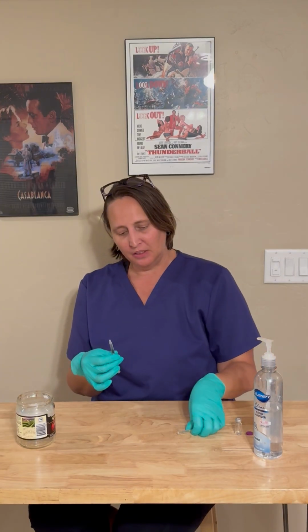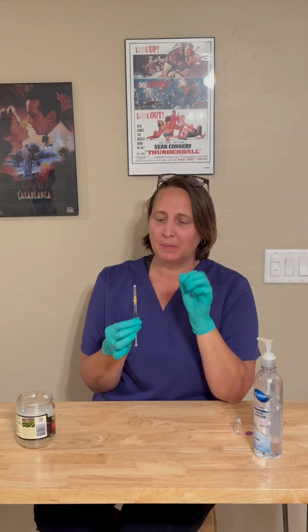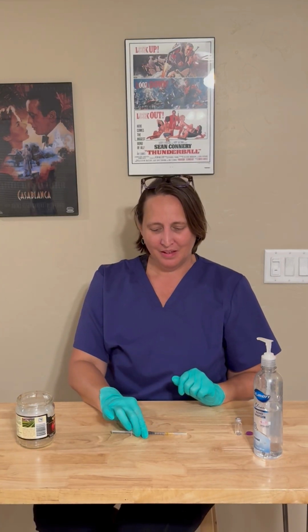Then you'll take your second needle, the one you plan to use for administration, and put it on your syringe. A sub-Q injection is typically given with a 25 gauge or smaller needle, and you do not want the length of your needle to be more than a half inch. Sometimes they make even shorter and smaller needles, but in our case, we're going to use a 25 gauge half-inch needle. And now you're ready to administer your medication. I hope you enjoyed learning about the foundational skill of drawing up a medication from a medication vial. Thank you.